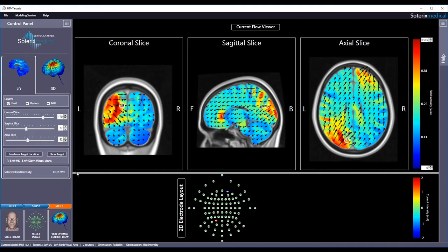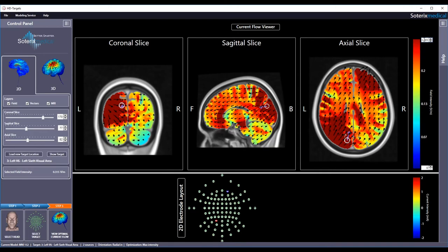This shows that the max intensity constraint induces more current flow in the target but will also lead to more current flow in other regions. This can be easily seen by reducing the maximum value on the scale bar to 0.265.